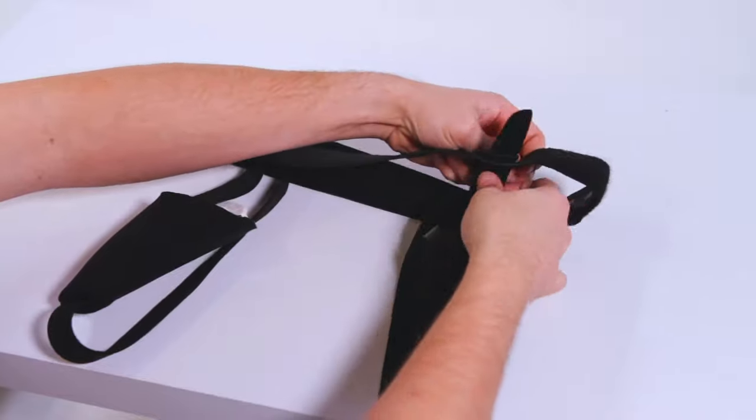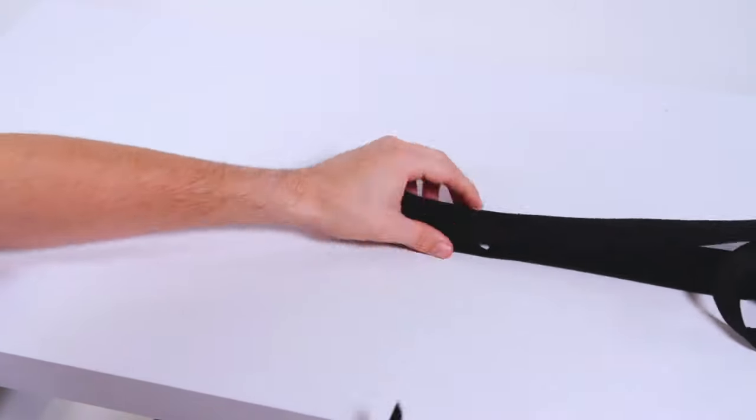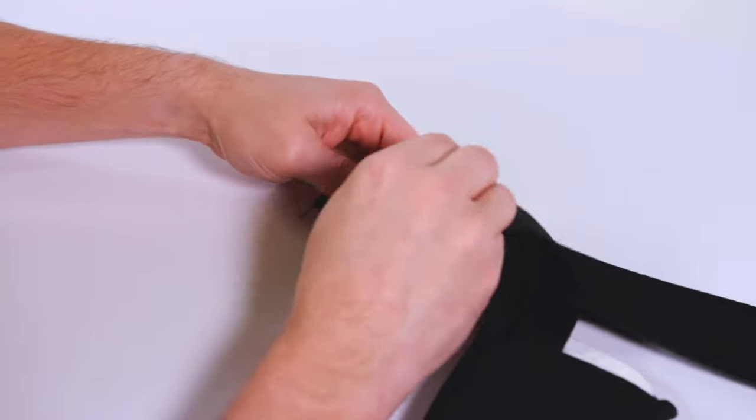For a single hernia, remove the extra pad pocket. To apply, start with straps fully loosened.